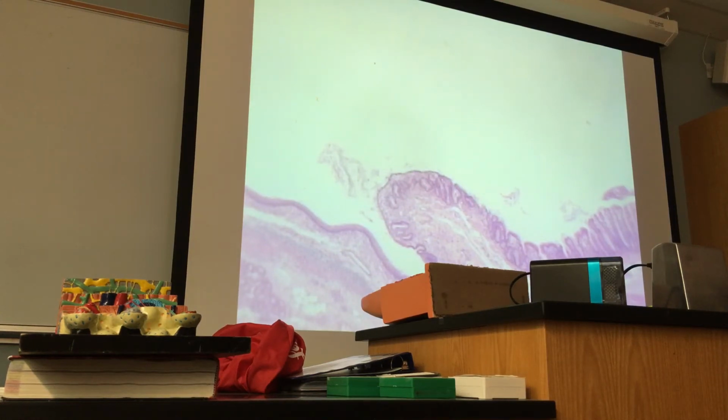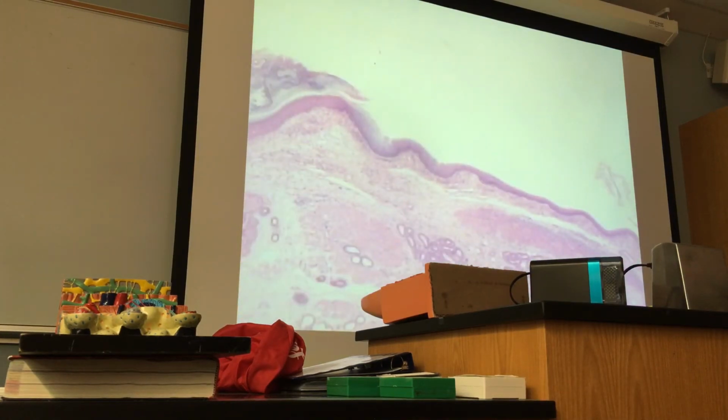From simple columnar to stratified squamous, non-keratinized stratified squamous epithelium.